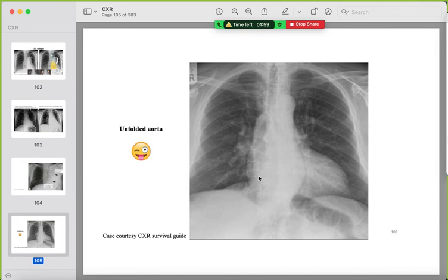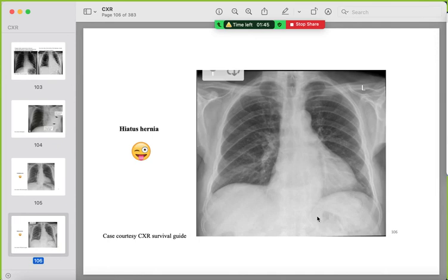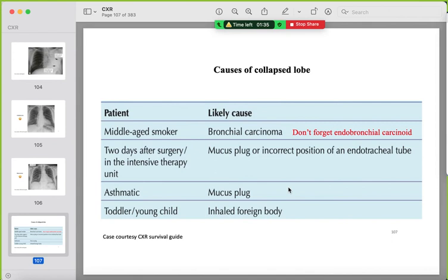Mimickers for left lower lobe collapse: unfolded aorta (aging-related, showing the aortic knuckle and descending aorta), and hiatus hernia — a fusiform-shaped structure with an air-fluid level seen retrocardiac. You should train your eye on all of these. This is a summary of the causes of lobar collapse.